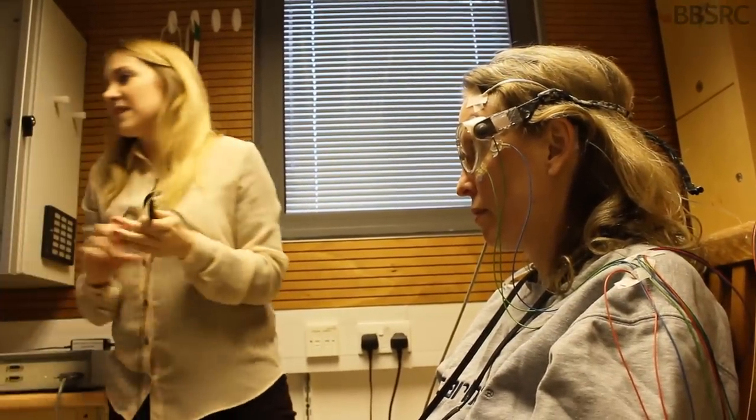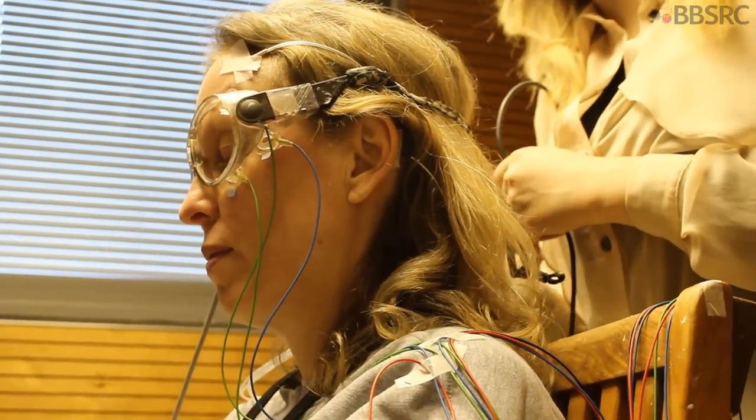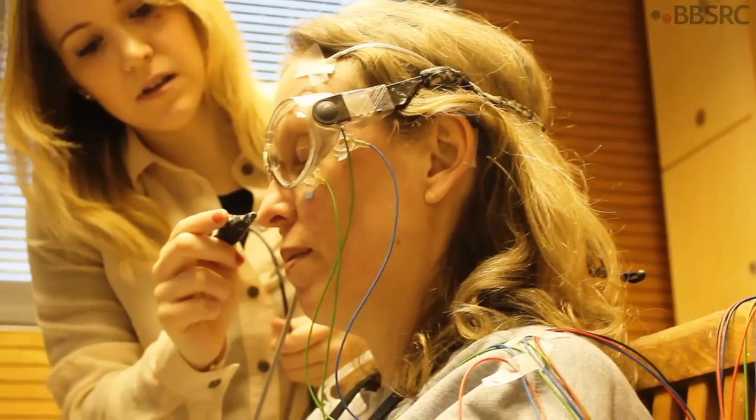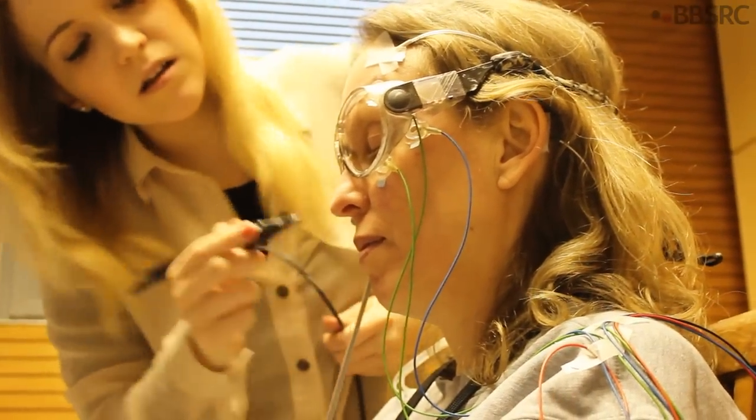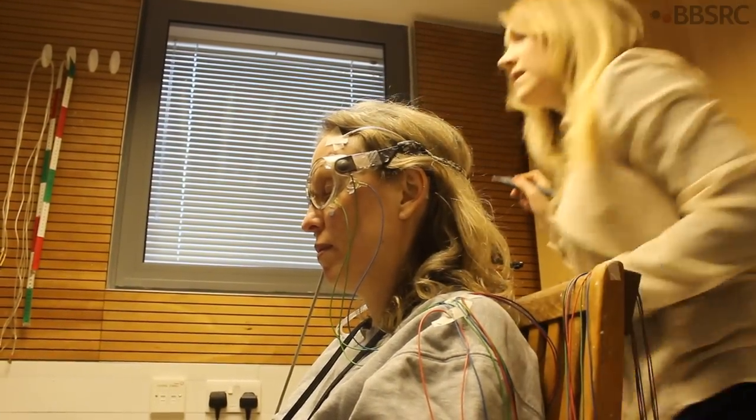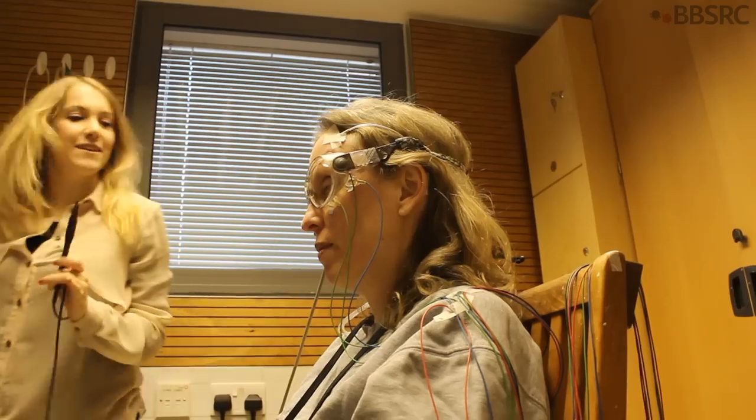It's really important that you stay as still as you can once we start. We'll go down your nose and press your cheeks. Excellent, good job keeping still. You can relax now.